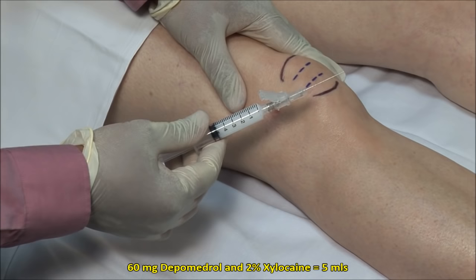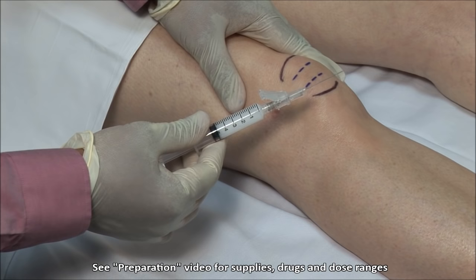Here I have a mixture of 60 mg of depomedrol mixed with 2% xylucaine without epinephrine to a volume of 5 mls, and I am using a 22 gauge, 1.5 inch needle.